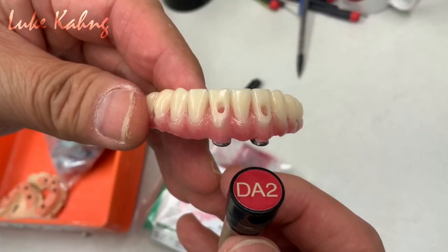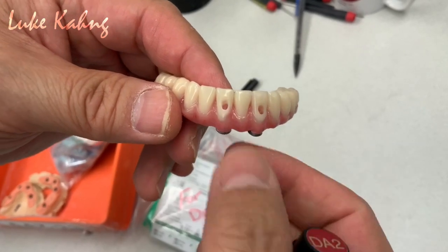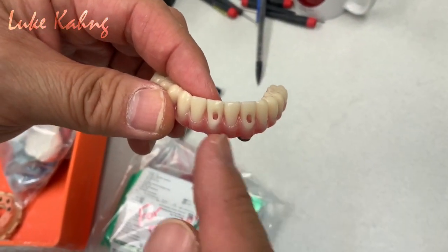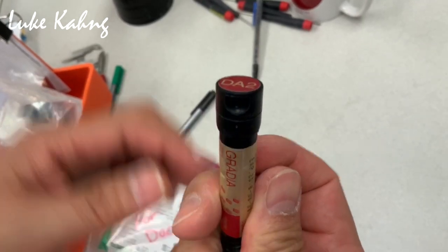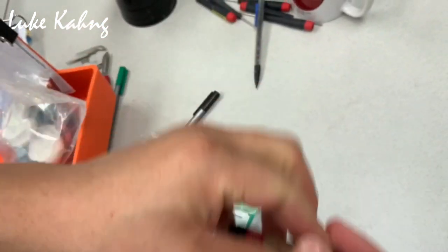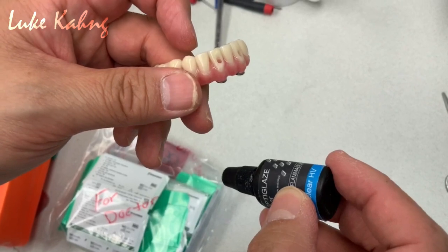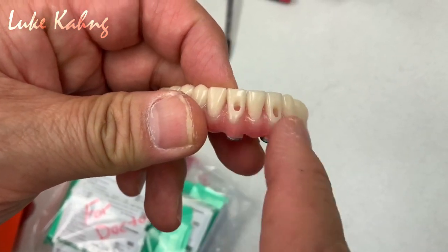All right, great. This is a message for Dr. Boyer regarding the hole. What we did, we already ground it and we already put the ceramic primer, so he doesn't have to do anything. Seat it in the patient's mouth, screw down, and he's trying to fill in. Here is the gradient we're trying to give to you. You can use the same one, so you can perfectly match the color. This much is enough, okay? And then after that, patching it, close it, and then you can use this optic glaze, squeeze it and brush down over there, and then light cure about 2 minutes and you get shine just like the others.